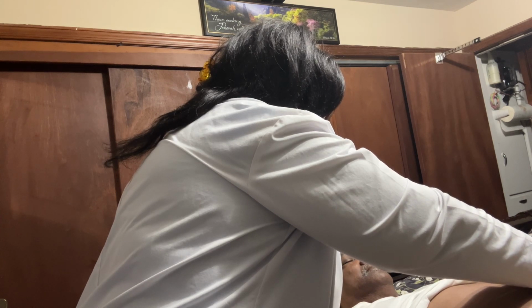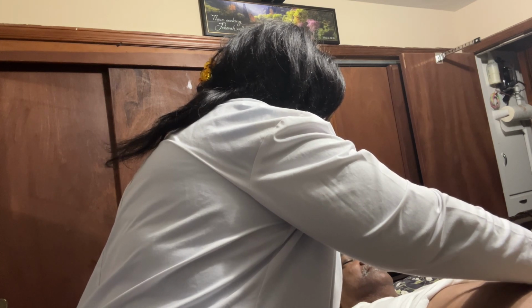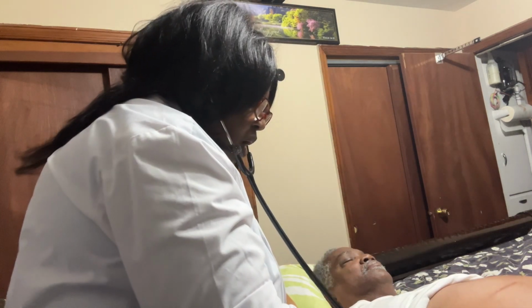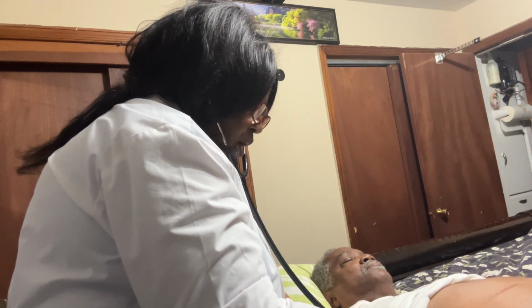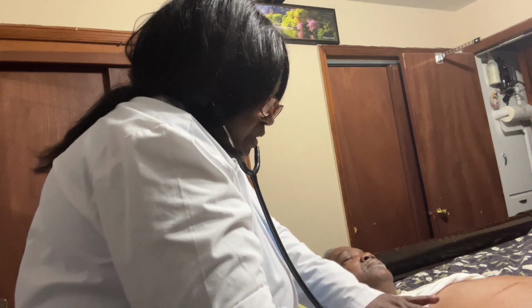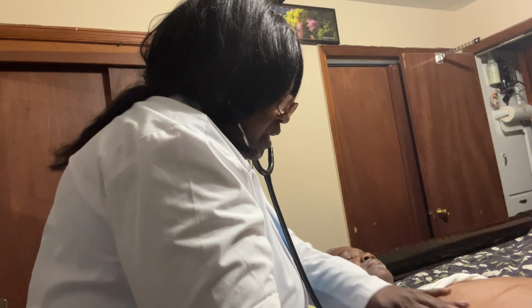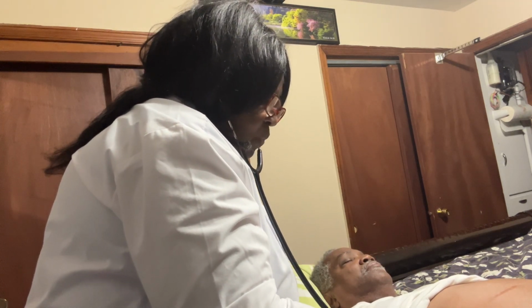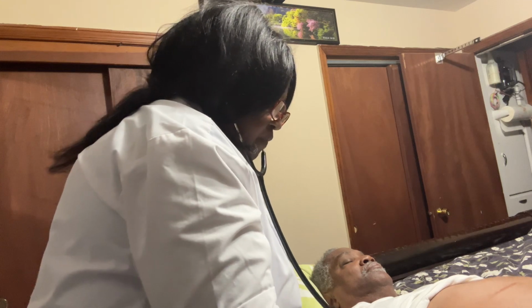I'm using the bell and the diaphragm. I did aorta, I did the renal, I did the iliac. Doing the right and the left iliac with the bell and the diaphragm.